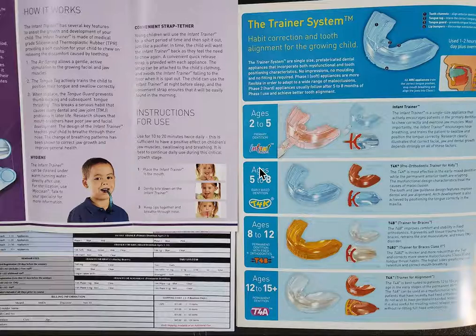Myofunctional design characteristics treat the causes of malocclusion. Okay, so it also helps with tongue position. So great, it helps them nasal breathe at night. So I would recommend that. Again, you're going to need to get soft and hard. So your lab fee is going to be somewhere around, with shipping, $150 per patient. So just things to know. And it comes in a variety of colors.